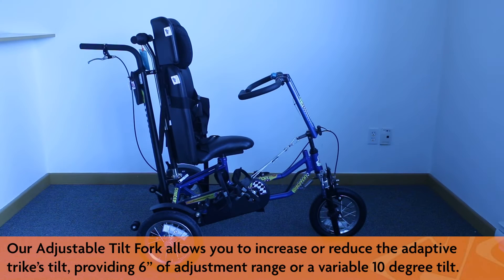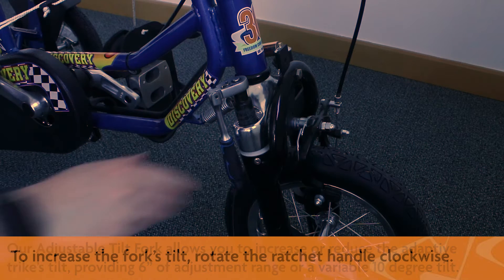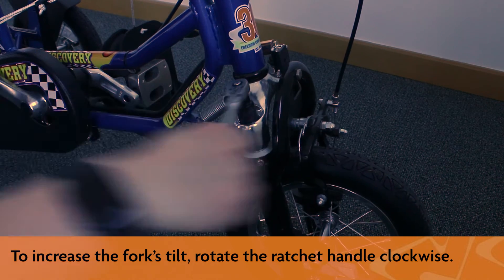Our adjustable tilt fork allows you to increase or reduce the adaptive trike's tilt, providing 6 inches of adjustment range or a variable 10 degree tilt. To increase the fork's tilt, rotate the ratchet handle clockwise.